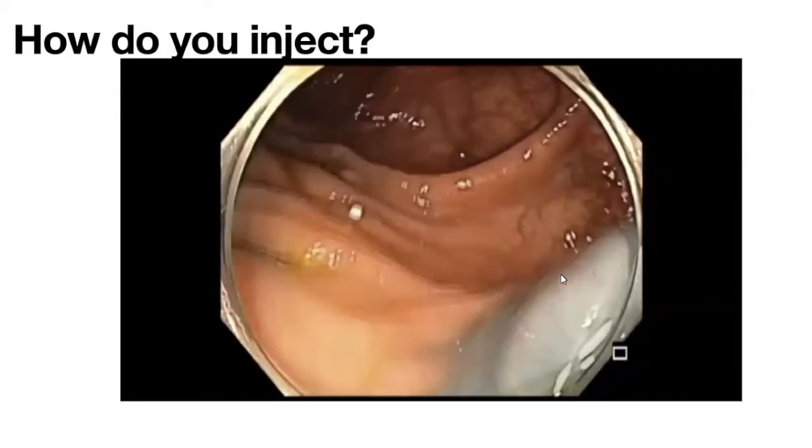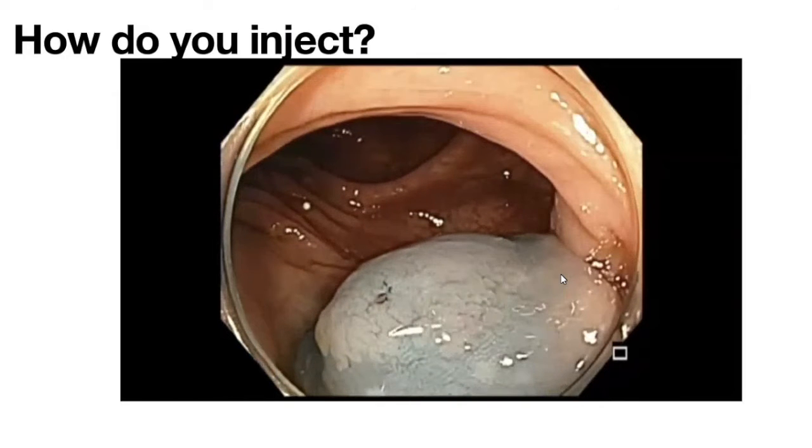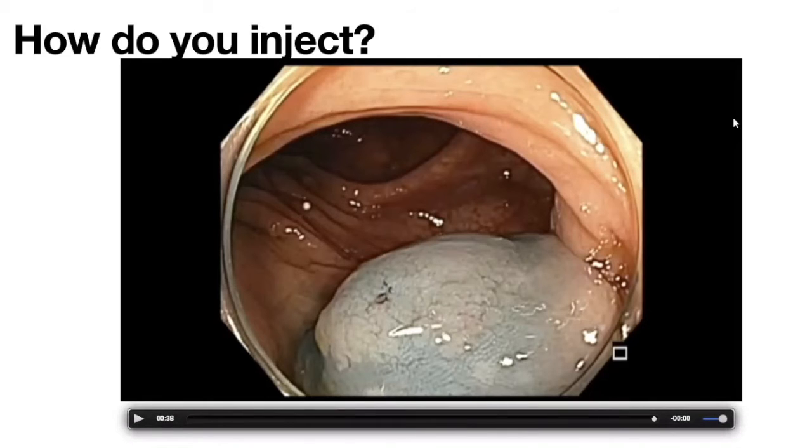So Norio, any comments on how to do injection? How do you train people? Basically I'm following your instruction, injection and then control the needle direction. Okay, all right. And sometimes I usually inject one puncture point, not multiple injection points, because it makes the bleb too large and wide. Sometimes it makes it difficult to capture with a snare. So instead of a mound, it becomes like a plateau. Yes, right. That's a very good point.